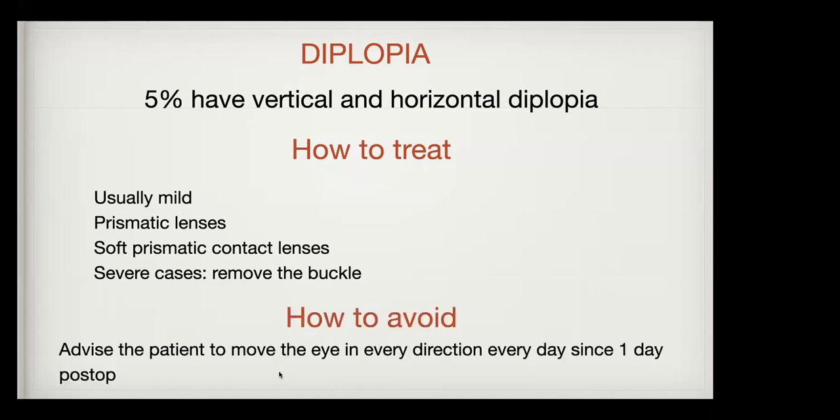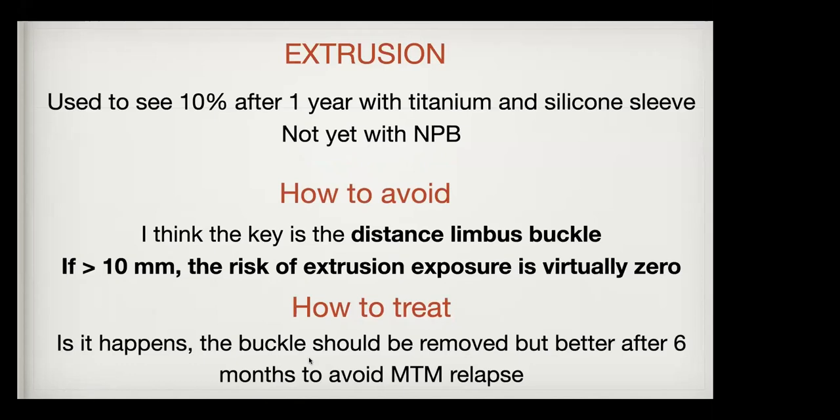But that's very, very rare. How to avoid? I always advise the patient to move the eye in every direction since day one, a few minutes in different parts of the day, especially for the first week, because we want to avoid the fibrotic encapsulation around the muscles that might limit the movement of the eye. So advise your patient to keep the eye moving.